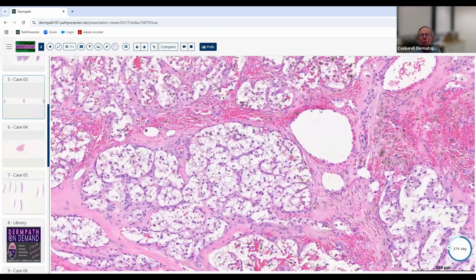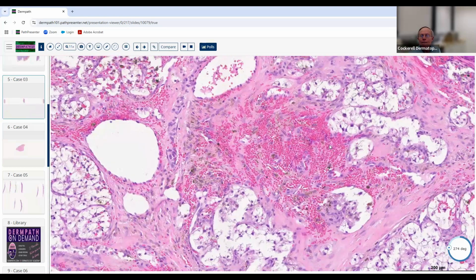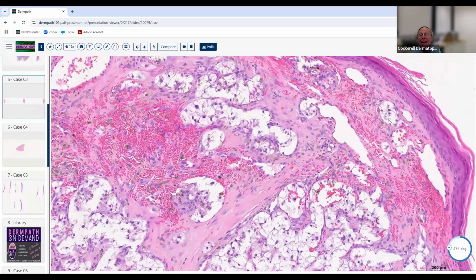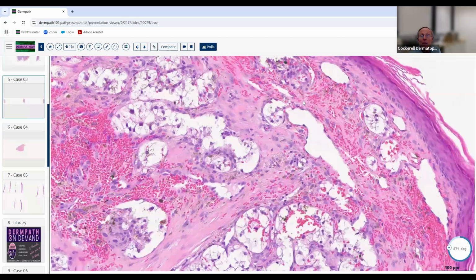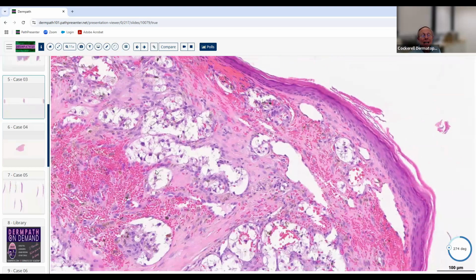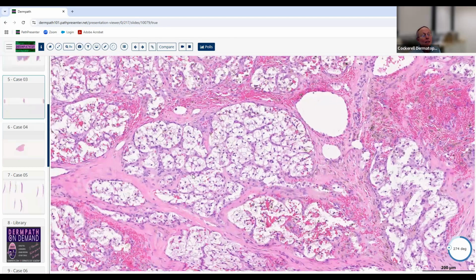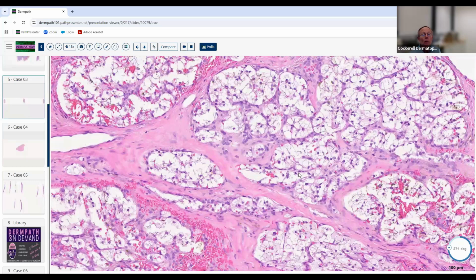And then you've got this very large blood vessel here. We've got a lot of extravasated erythrocytes over here, a lot of blood cells here. We might even have some vascular spaces in which there may be some neoplastic cells. Okay. And we just talked in the last case about the possibility of metastatic lesions. So here, these cells don't look like they're normally present in the skin. They don't look like, we mentioned balloon cell nevus, for example. Well, these don't look like nevus cells at all.